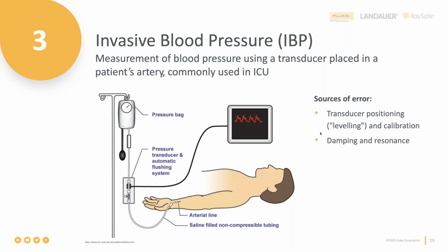In all of those cases, and some more that I will mention in a few seconds, hospital staff uses what's called an arterial line, or ART line, or A line, which is basically the invasive blood pressure monitoring system. An ART line is a thin catheter that you can see on the slide that is inserted into a patient's artery.